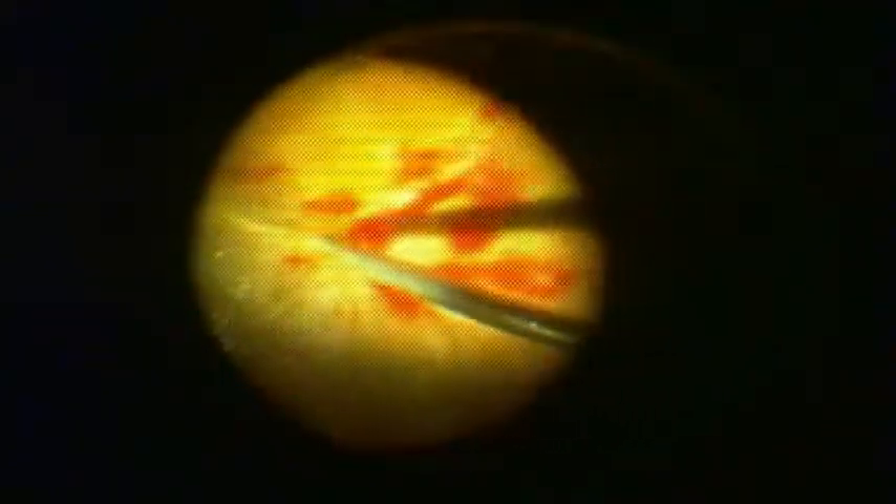Diathermy is used to control the bleeding, and then it is aspirated carefully using soft-tip cannula. To complete this, the IV pole can be elevated and even laser photocoagulation can be applied to the bleeding vessels.